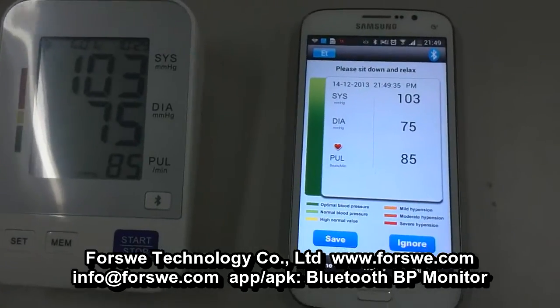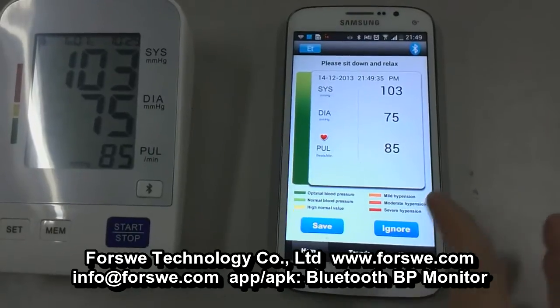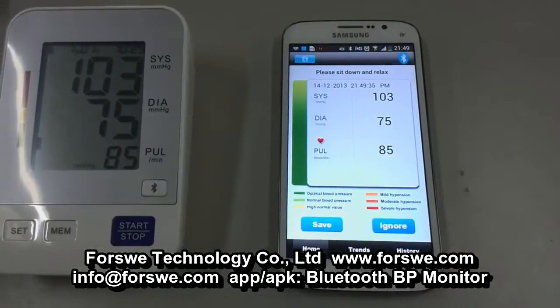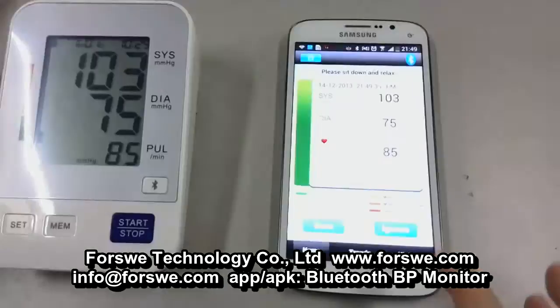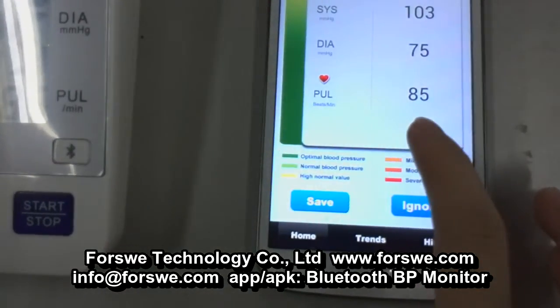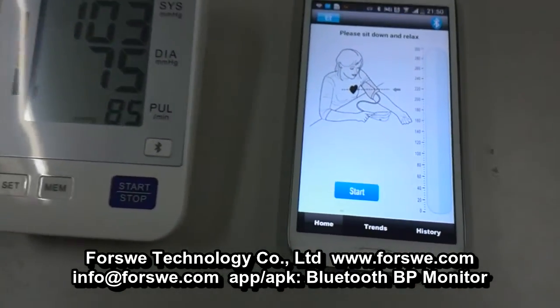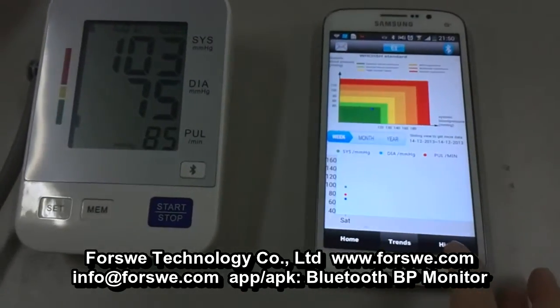Press the button 'Save' to save the record. On this page you will see the general blood pressure trends. You will see six different colors, and each color stands for a different blood pressure trend level. Now press the button 'Save' and go to the trends page.